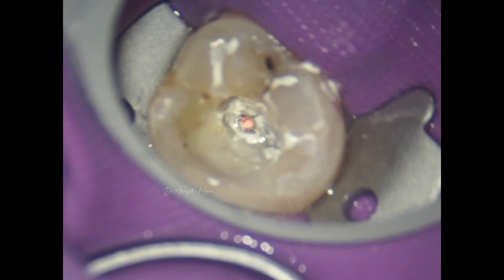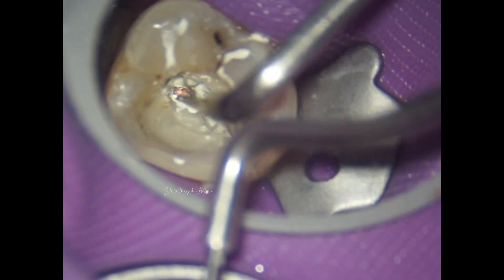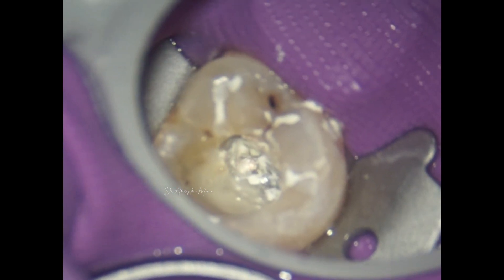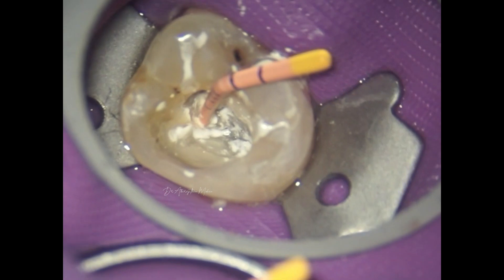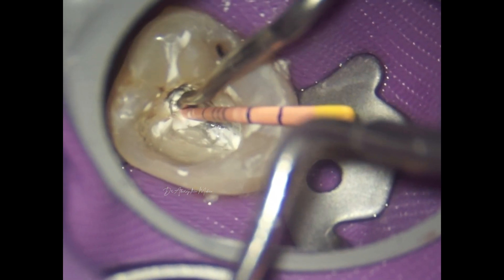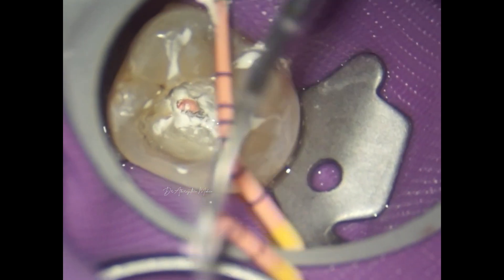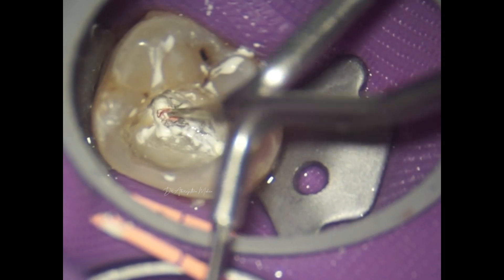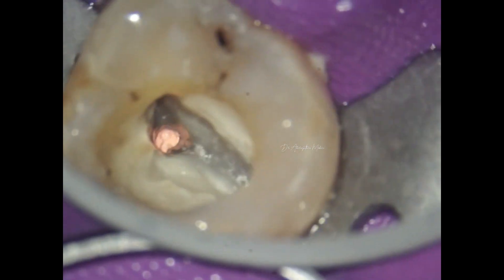You can also see the importance of the right armamentarium — the obturation pen or downpack unit is precisely able to deliver the GP deep down the orifice without blocking the second orifice, and I'm able to easily access the other canal without obstruction. The palatal canal was obturated with a six percent cone, but the two orifices that are very close to each other were managed with four percent files.